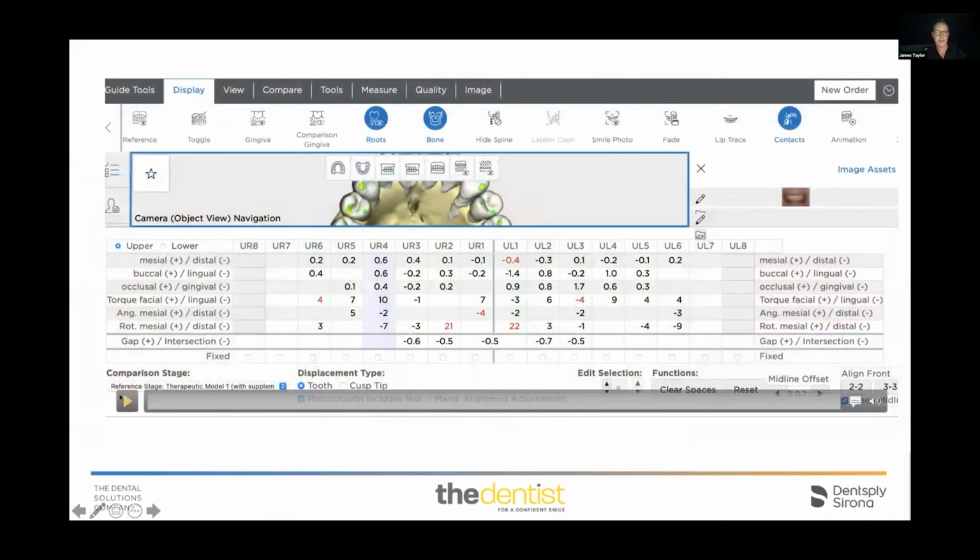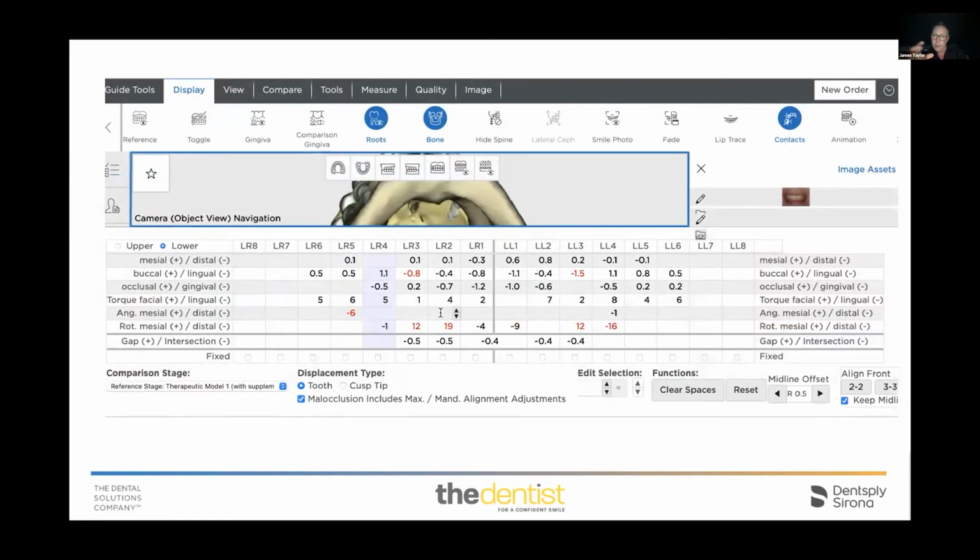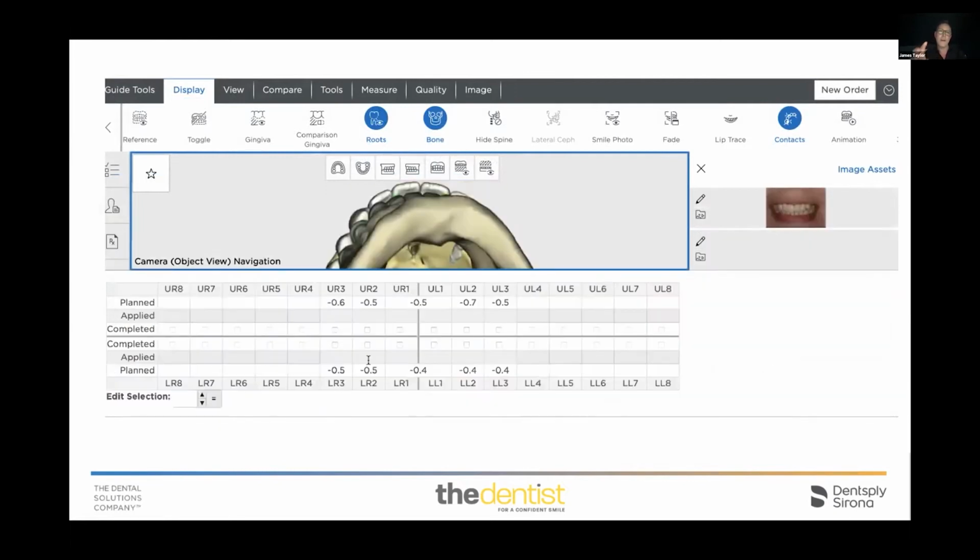And as you see here, this is what I'm looking at as far as the numbers. As well as looking at the teeth move, you can see the actual numbers of what you're achieving and what you're trying to achieve. The red numbers are numbers where the movements are actually quite big movements. So things you need to be aware of, and try, if you can, to limit those movements. So where I see the red, I'll always go back and see if there's any way in which I can minimize those movements and change the dimensions.